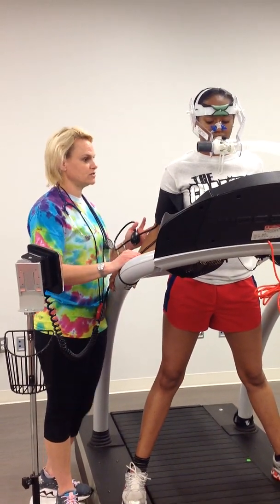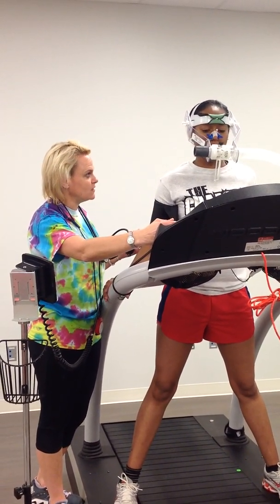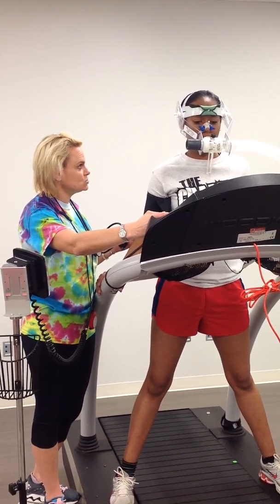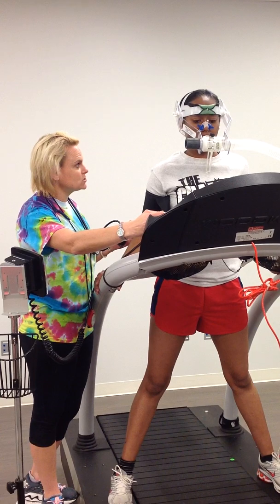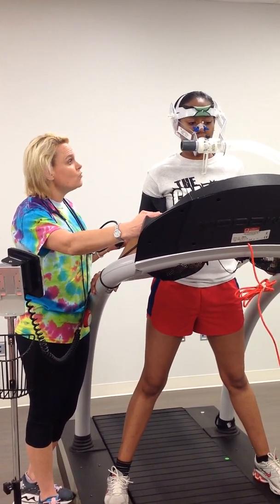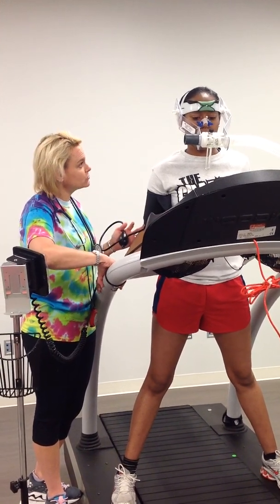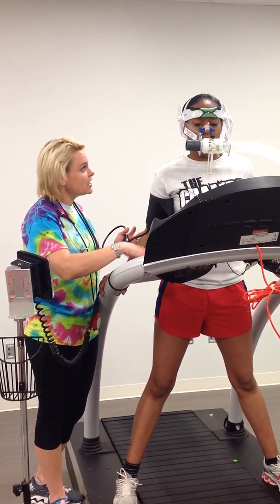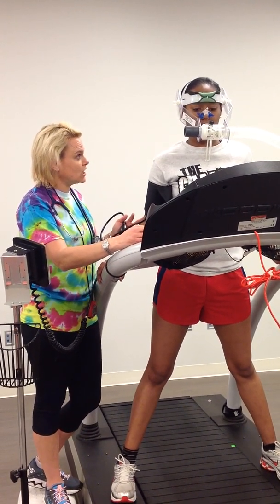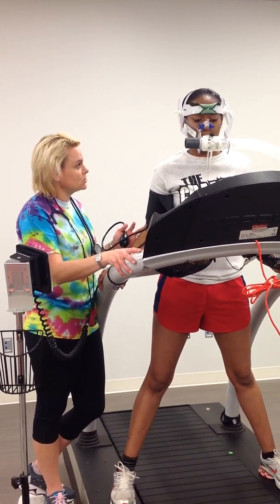We're going to get ready to start the test. What I'm going to first do is increase the speed and grade up to our starting speed. Once we get there, I'll give you the instructions — when you're ready, go ahead and step onto the treadmill. At that point we'll start the test. When you don't have anything left in you and you're done with the test, I want you to grab these handrails, straddle, and the test will stop. During the test, I want you to try not to use the handrails — if you need them to get your balance that's fine, but I don't want you holding on during the test.